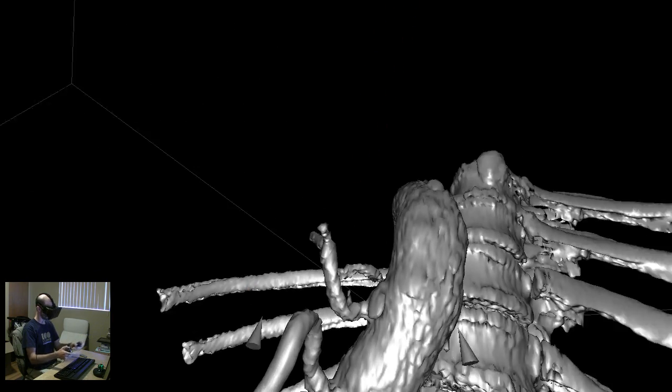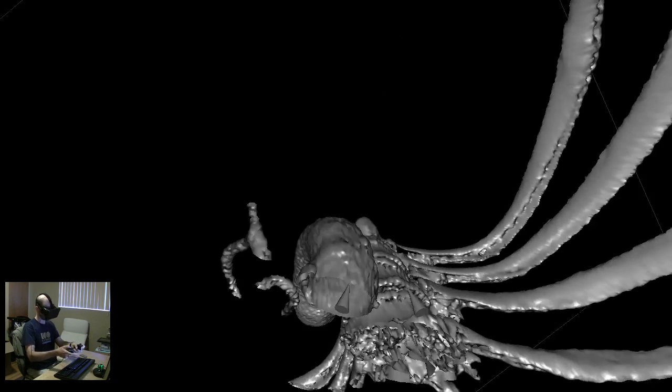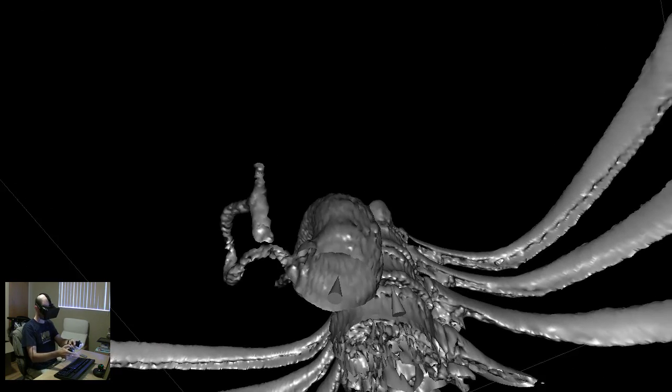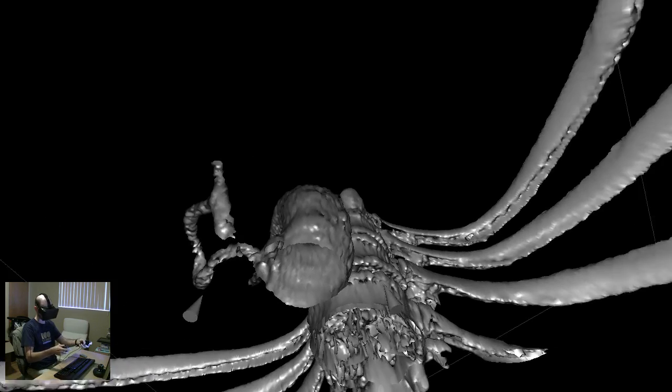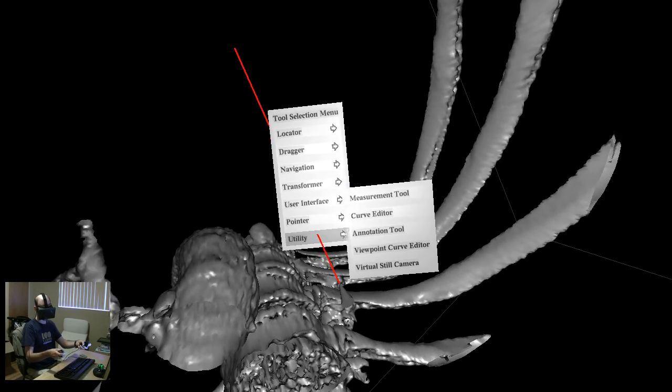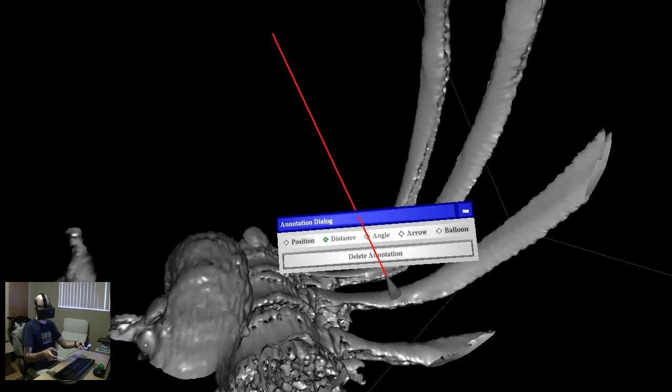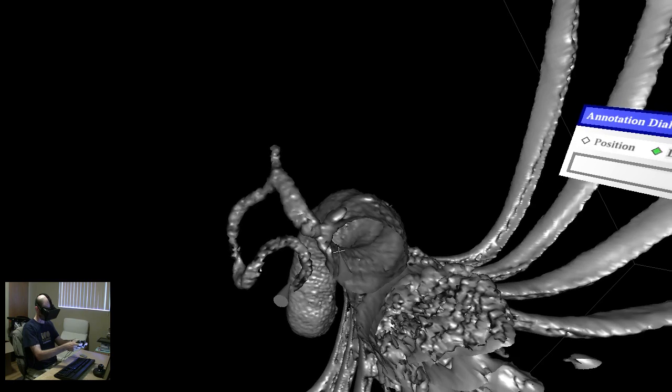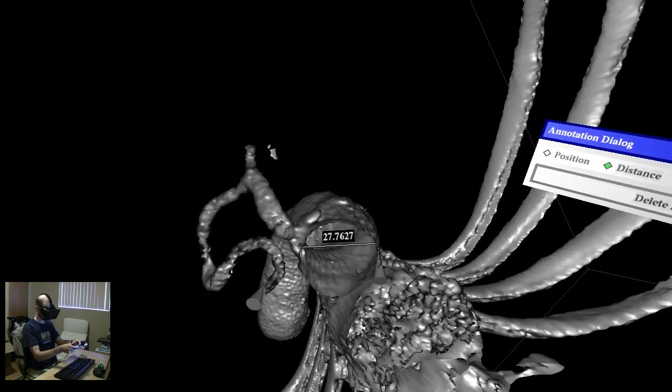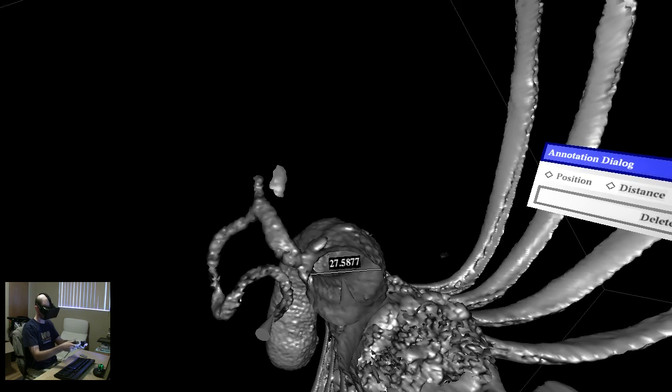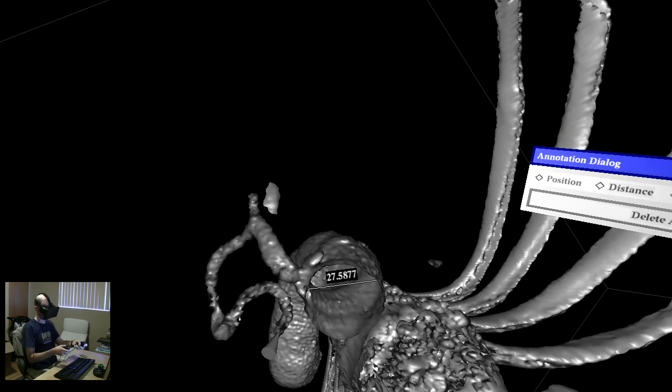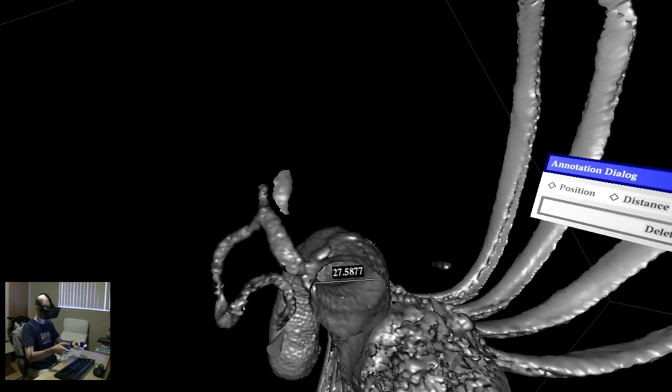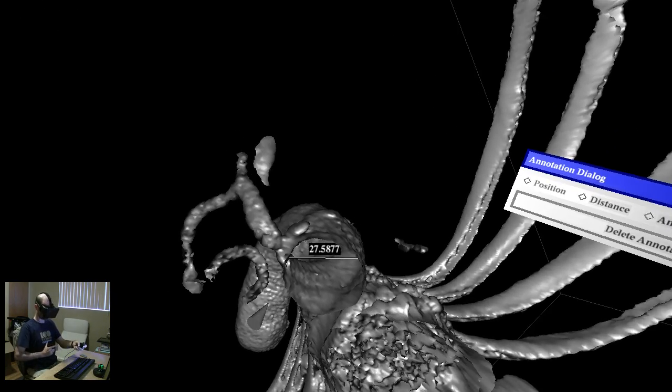So here I want a clipping plane, so I can just cut away a part of the data I don't want. So I can get a nice, juicy cross-section right there. And so now I can take a measurement while I'm holding that cross-section open. I can go in here and just measure that. I put a measurement marker right there. Put another one right here. And you see that the diameter here is 27 and a half millimeters, give or take. So it's a little bit more than an inch. As I said, it's a bit thicker than my thumb. It's quite big.